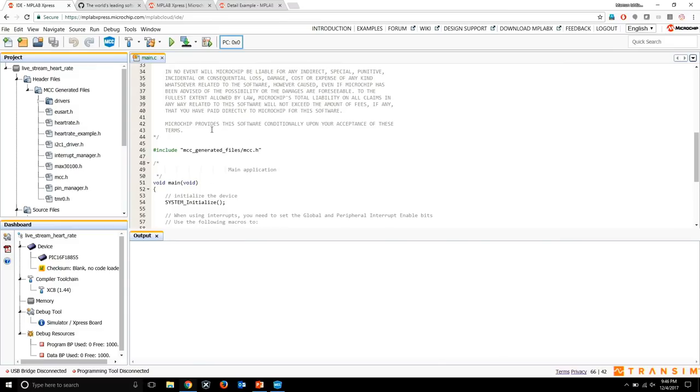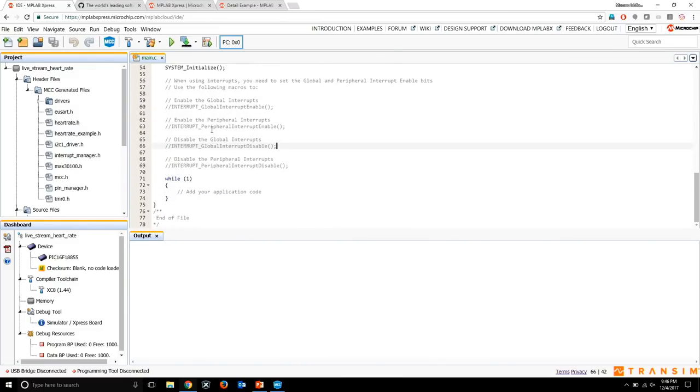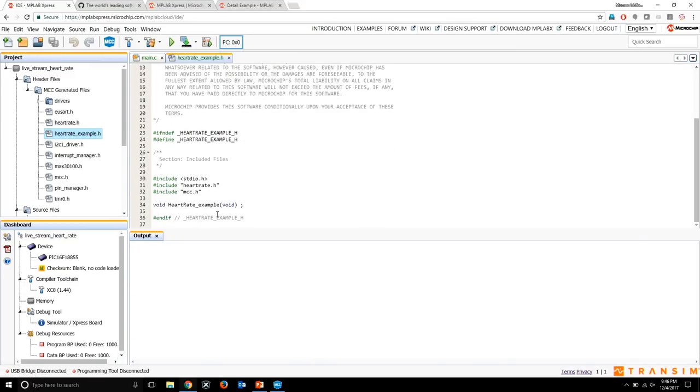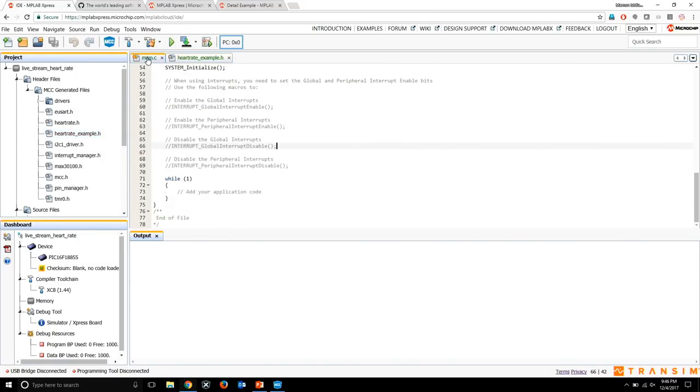So the easiest thing I'm going to do right now is just use the heart rate example. I'm going to click on heartrateexample.h, and if you scroll down, you can see the heartrateexample function. I'm going to select the whole function, copy it with Control-C, and go back to my main.c. Inside of this while one loop, I'm just going to paste that. Make sure to get rid of the void inside of it. And once you do that, that's pretty much it.